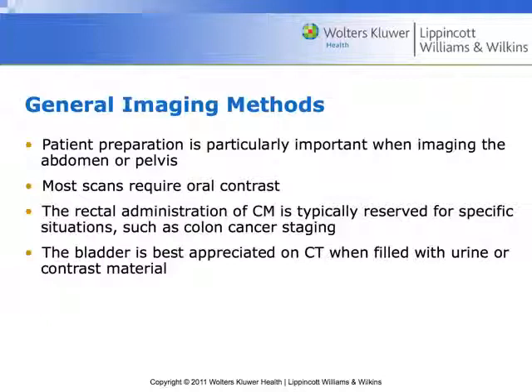Now, occasionally we have to use rectal administration. Typically, that's not too often. Some places it's part of an ER protocol just to increase patient throughput, or at times with colon cancer staging. And then the bladder, a lot of institutions will require us to do like a bladder delay, like a 5-minute delay after intravenous contrast administration, just to better visualize the bladder. In the case of when we're doing like a renal stone protocol, it's best to scan the patient with a full bladder or ask them not to void prior to scanning.